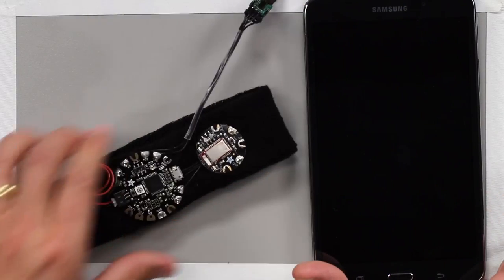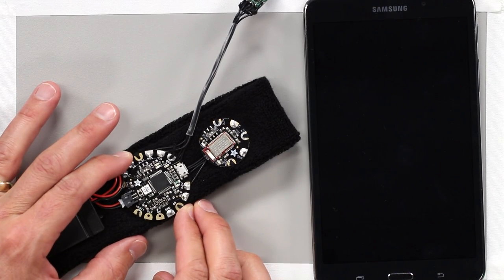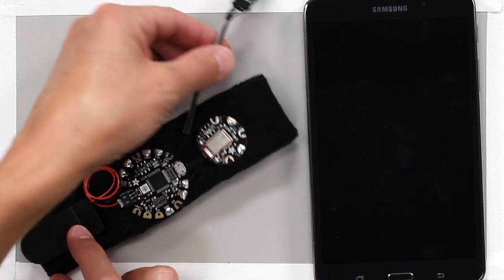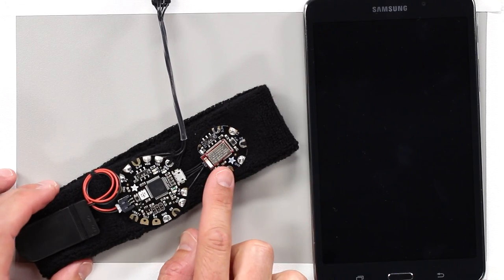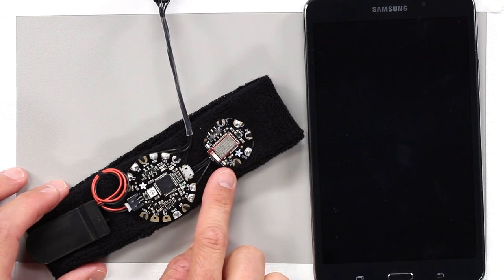So I promised you one last demo here. We're going to clear the deck and bring in a special demo that Gordon created. I mentioned earlier the Adafruit board. We've got the Adafruit Flora here, wired up with a battery and our heart rate monitor, the MAXREFDES117, that we've been talking about. We've also got a Bluetooth low energy communications board. I think this is the Bluefruit.